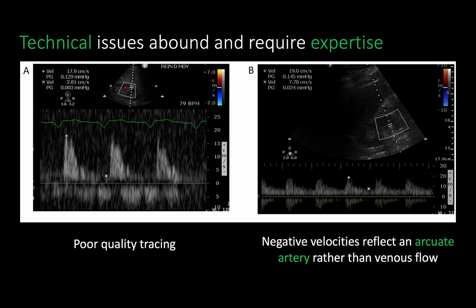Intrarenal Doppler is probably the most technically challenging of all venous congestion assessment techniques. There are three main reasons. First, the vessels being imaged are quite small. Second, the area to image can be difficult to assess. Third, this area is subject to major shift of tissues when breathing. In combination with small vessels, this may lead to interrupted signal acquisition that is incompatible with proper interpretation.